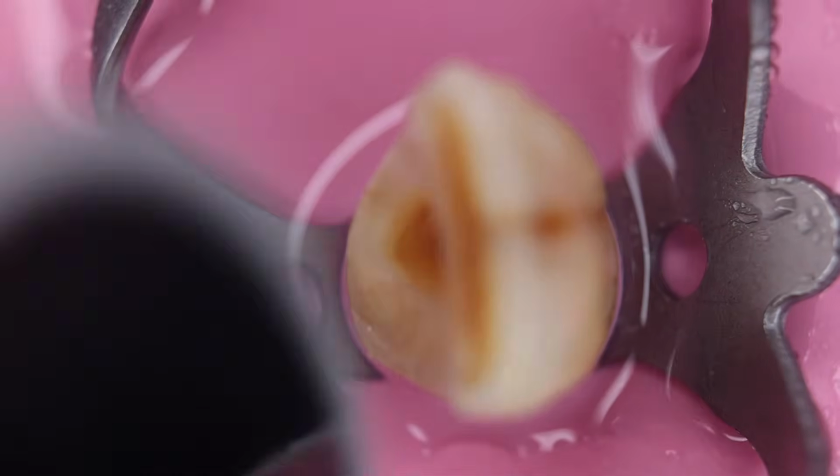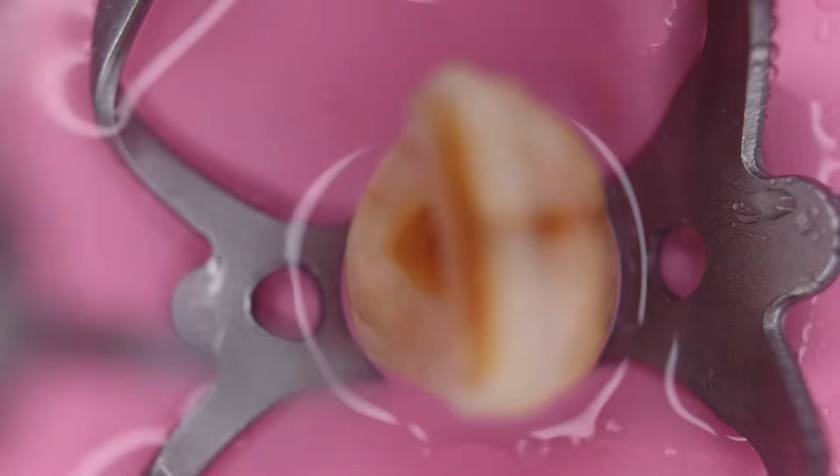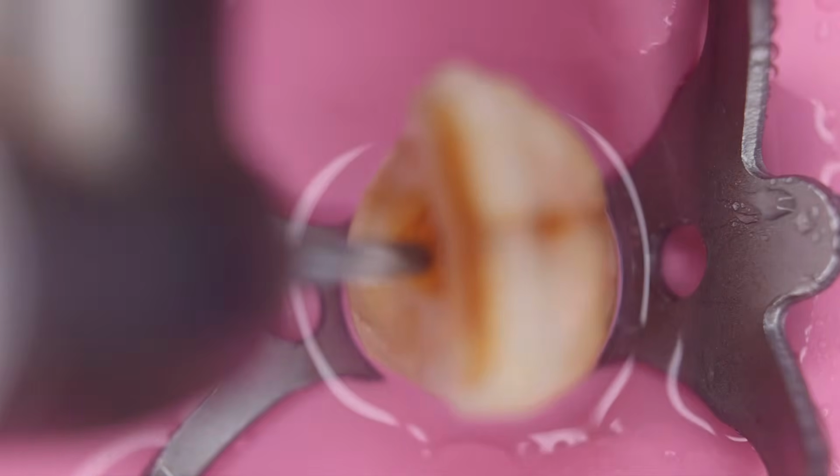And now you can further define the axis with again the AtoZ bur to have smooth walls. So this is the last segment of the bur that we are using.